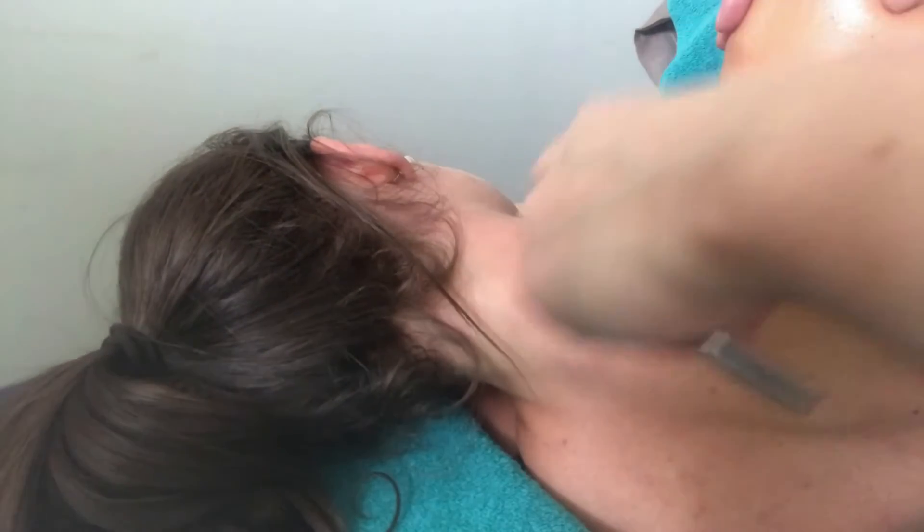In a side lying position, you can take the instrument assisted massage through into the upper traps and into the suboccipitals at the back of the neck. You can also take the shoulder into a slight traction to create a greater stretch on the upper traps tissue.